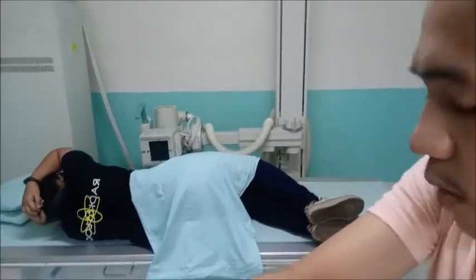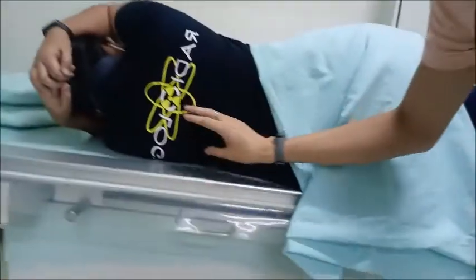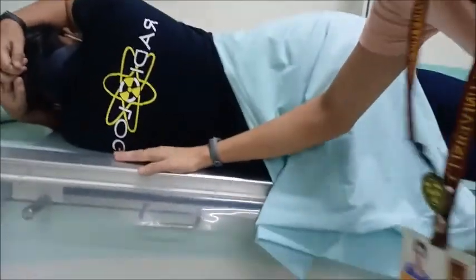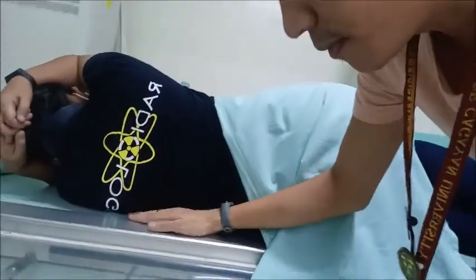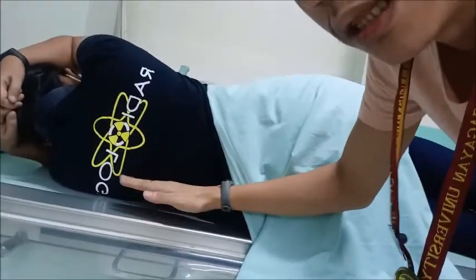Yes. So in the clinical setting, they usually have a foam wedge for the patient to lie on. For example, in this case, we have no foam wedge for the sake of demonstration. There is no distance between the table and the patient.